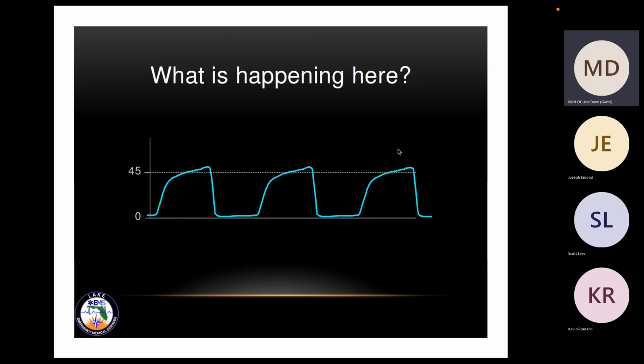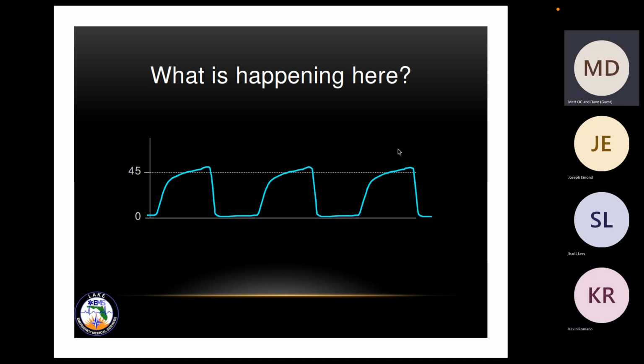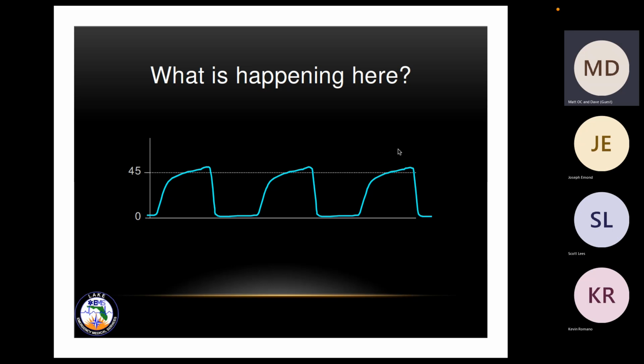Yeah, there are multiple areas of the alveoli that are off-gassing or being exchanged this time. So we don't have a smooth phase 2 there. It's lumped a little bit. So for some reason we're not getting a good release of gas all at once. Right. So what kind of patient would you see this in? COPD, someone who has crackles in their lungs. So bronchoconstriction, bronchospasm. Bronchospasm would be another one, yes.